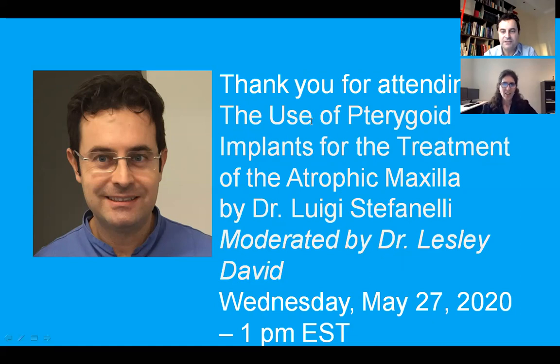Yes, I think that makes sense. We're dealing with scenarios with anatomic risks and a potentially high complication rate, which obviously depends on the skill of the surgeon too. You mentioned that although we've talked about pterygoid implants for many, many years, it's not universally applied among clinicians, oral maxillofacial surgeons, periodontists, or those executing this treatment. Certainly this gives it more of a safety zone, knowing that you can plan the implant on the computer and then execute it in a precise fashion.